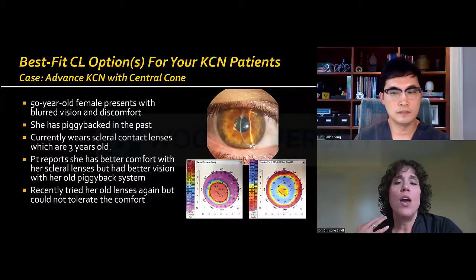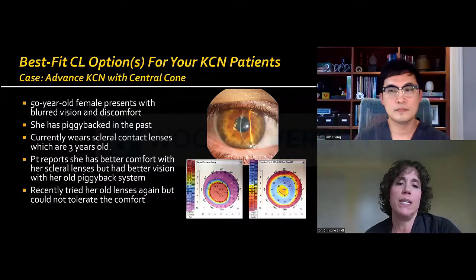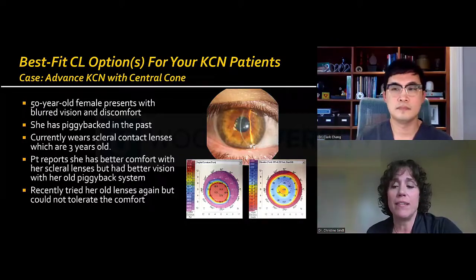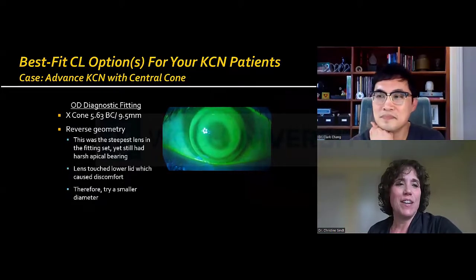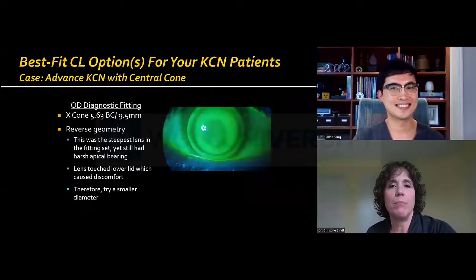And she really did not want to consider surgical options at this time. She really wanted to stay in her contact lenses. And so she came to me wondering if she could go back into GP lenses. I know this sounds a little unusual, based on everybody's trying to push people into scleral lenses, but she really wanted to go back to her GPs.